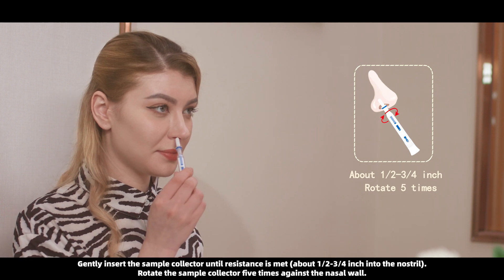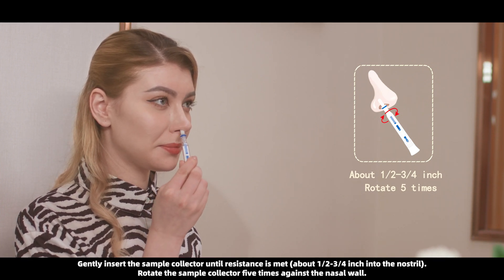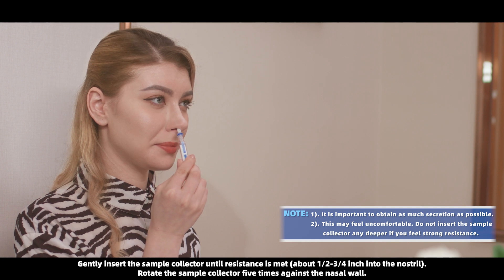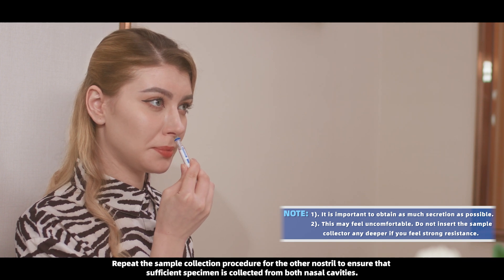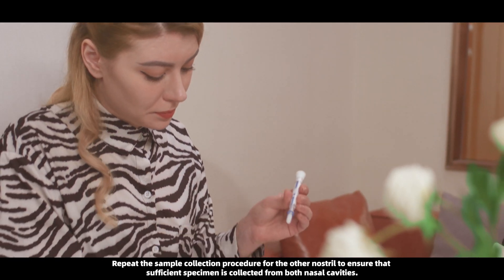Gently insert the sample collector until resistance is met, about 1/2 to 3/4 inch into the nostril. Rotate the sample collector 5 times against the nasal wall. Repeat the sample collection procedure for the other nostril to ensure that sufficient specimen is collected from both nasal cavities.